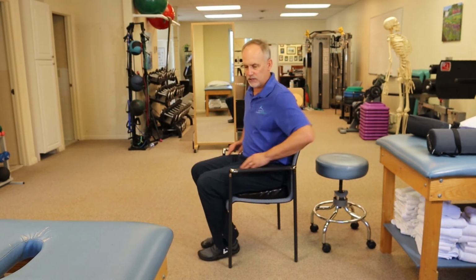What it does is it typically will tilt our body a little bit forward, and naturally as it tips your body forward it creates a natural indentation and roll. So it's another option, I call it our bonus, that you can use when you don't have that back support or that support from the back of the chair. You really need it on a firm surface, but like I say, football stands, things like that, great little option.